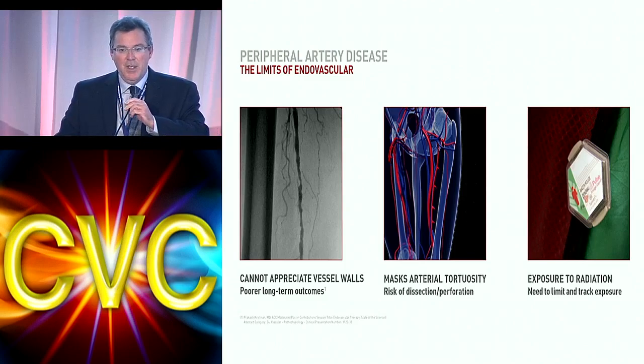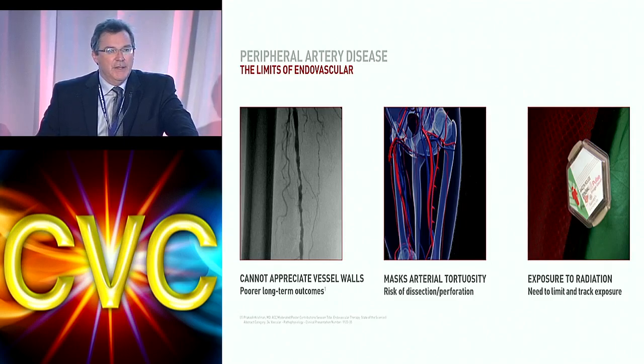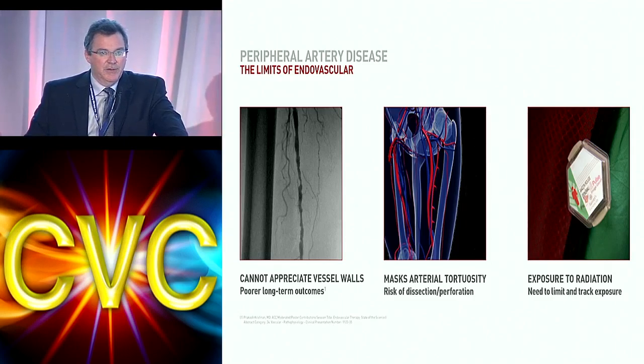It masks tortuosity, as we've seen. Dr. Walker had that bent knee there. When you have the leg straight, you don't see the tortuosity of the vessels and where they dive down. And again, you have exposure to radiation. You have to track it and limit it. I've known some people who put their badges in their back pocket because they don't want to know how much radiation they're actually getting.